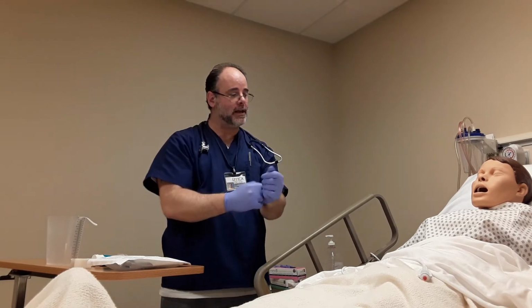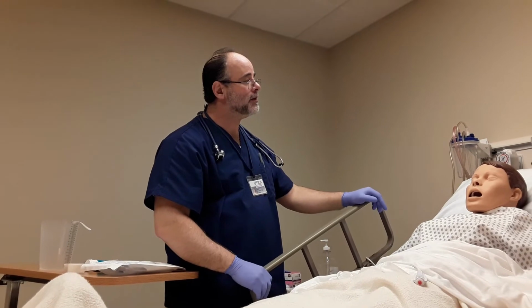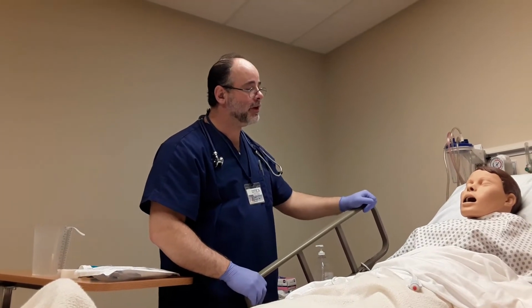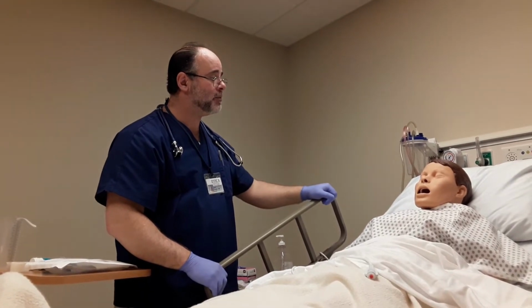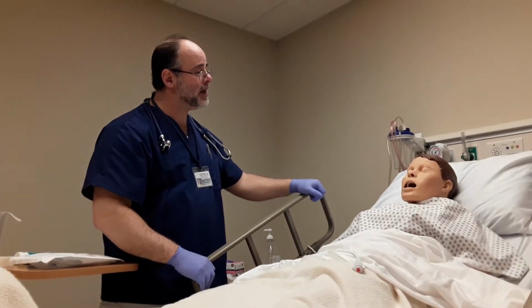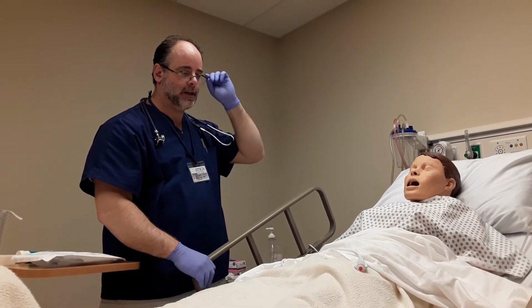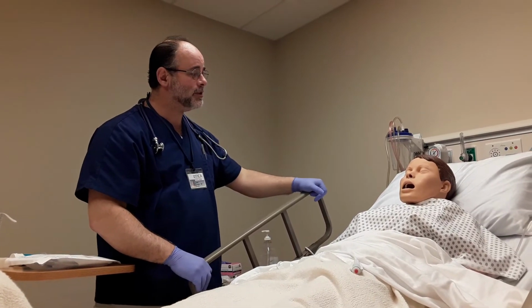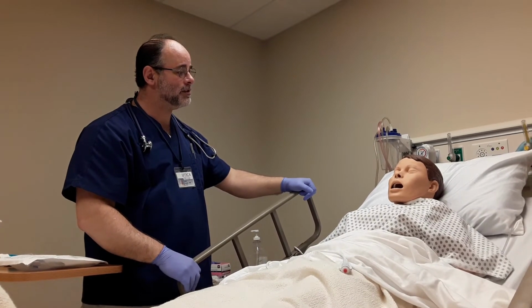So, Mr. Green, when I get this going for you, I'm going to ask you to swallow at one point, okay? There's a sign above your bed that says you're NPO, so I'm not allowed to give you any sip of water or anything like that to help with the passage of the tube. Have you had a tube before, by the way? That's always a good question to ask for any skill if they've had this procedure before, so you kind of know where to start with their education as well.